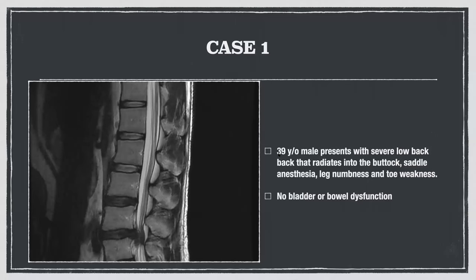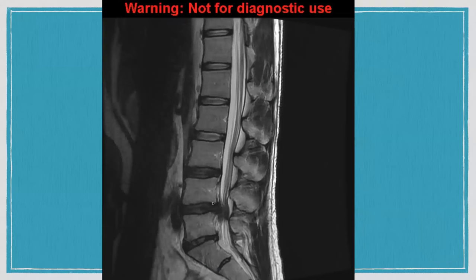Case one: a 39-year-old male presents with severe low back pain radiating into the buttocks, saddle anesthesia, leg numbness, and toe weakness, with no bladder or bowel dysfunction. On the sagittal image near the midline — sacrum, L5, 4, 3, 2, 1 — the spine looks reasonable overall, with some disc desiccation. At L4-5 there is a large disc herniation/extrusion coming out, looking like a tail, and the cauda equina nerve roots appear severely compressed.